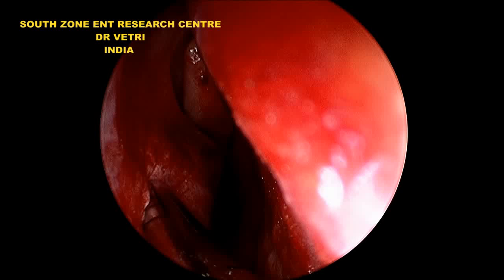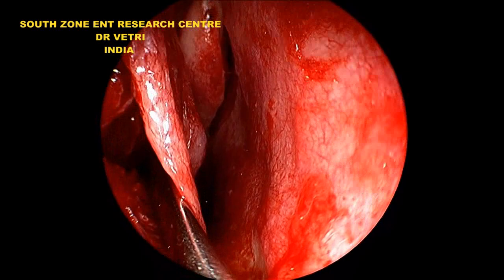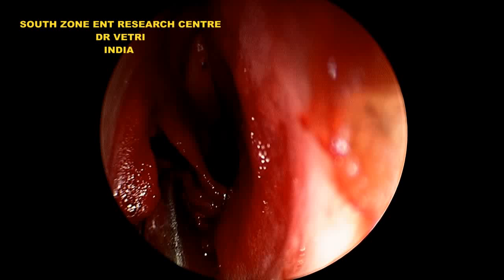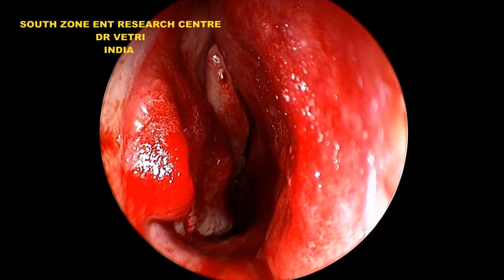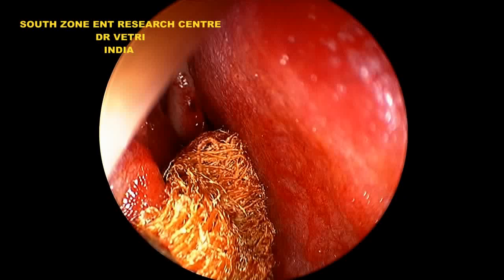The same procedure is continued on the right side — remember, the whole procedure is done under local anesthesia. This is the final appearance of the inferior turbinate after reduction. The nasal cavity is packed.